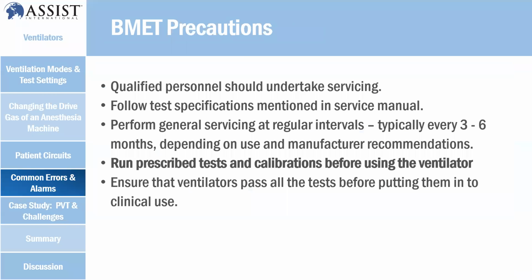When you talk about BMET precaution, always remember that qualified personnel should undertake the service. You should know your ventilator very well and get to know the manual. Follow the test specification mentioned in the service manual, or follow the checklist properly.